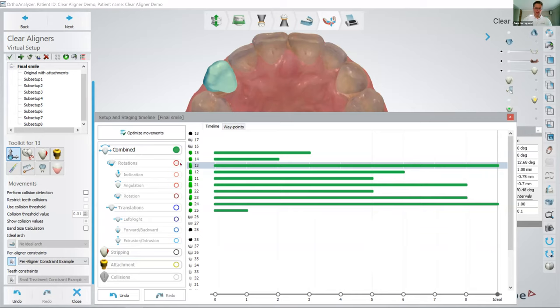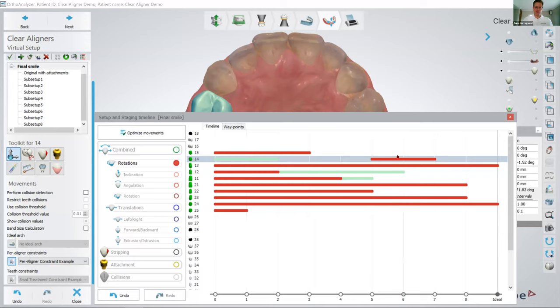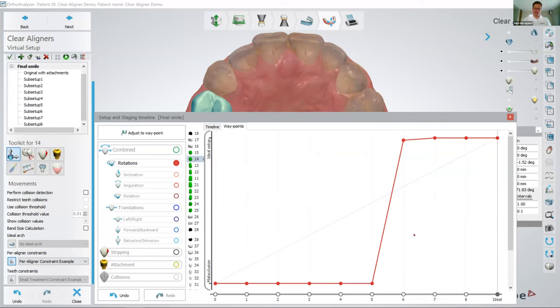So if I want to look a little bit more into the situation, I can go and say to this tooth, okay, I know that there are some rotations going on, but maybe I would like to have the rotations not in the beginning of the treatment, but I want to have them a little bit later down the line. So I will wait with the rotations due to collisions maybe. And then the rotation will happen in aligner number 5, 6, and 7 instead of in the beginning. And that will also reflect the waypoint and the speed. If I think it's going too fast, I can lower the speed a little bit like this to a more slow curve.